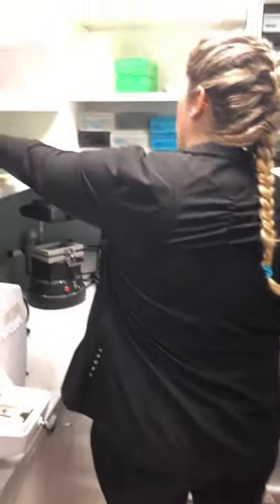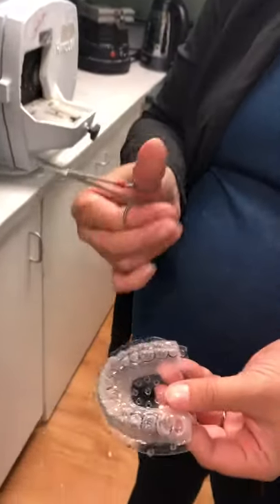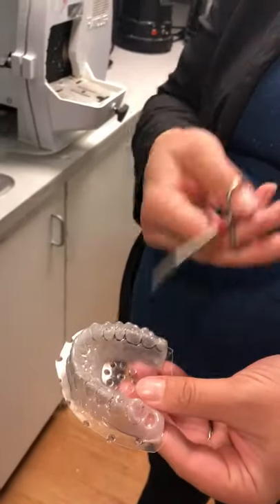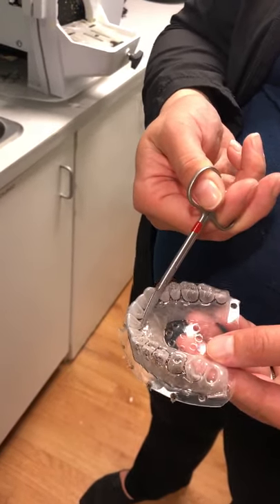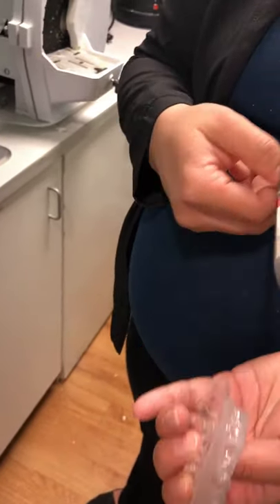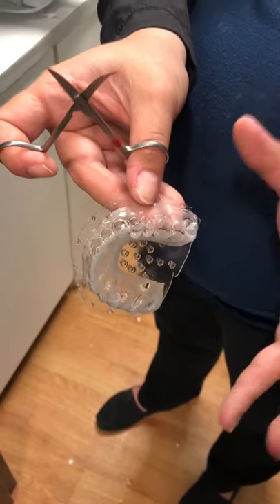We're gonna start to cut so you can see. What you want to make sure is that you got enough suck-down or vacuum when you made your tray — that you can see that gingival margin all along the linguals, all along the buckles. If it looks real faded and you can't make that distinction, that means something went wrong in the making of your models.